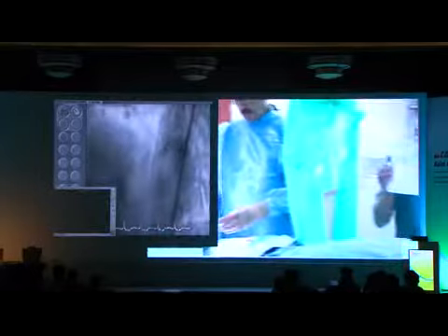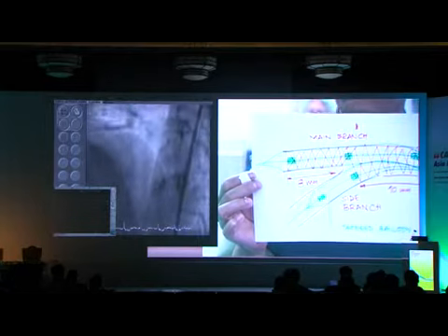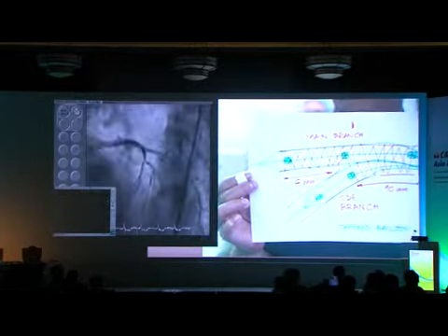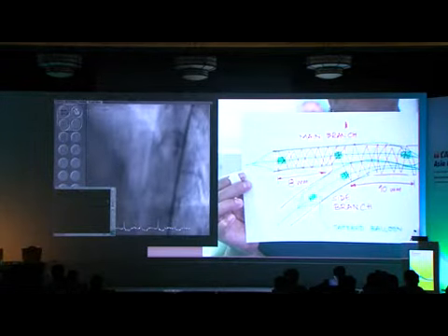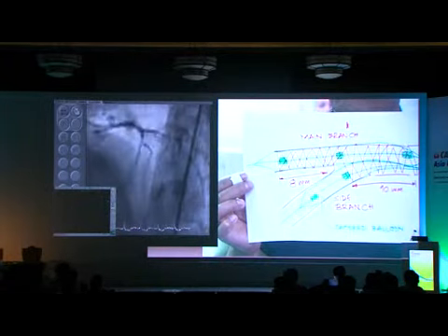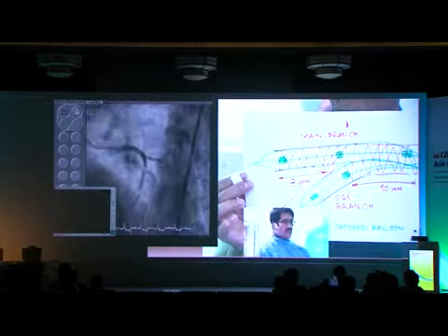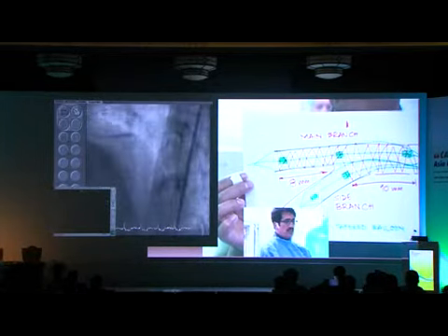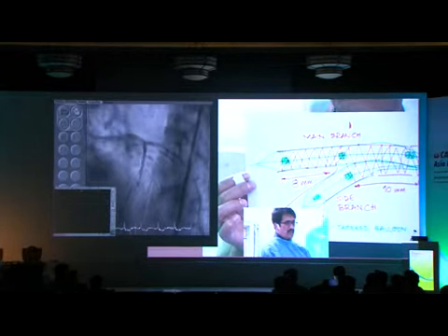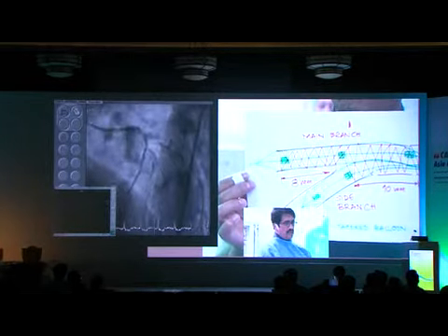We have actually, so the 8 millimeters is distal to the carina. 10 millimeters is proximal to the carina. So this length is 18. The 8 millimeter is a set distance. If you choose a longer length, like instead of 18, I choose 24, the 8 still remains constant, and the back portion will increase from 10 to 16.